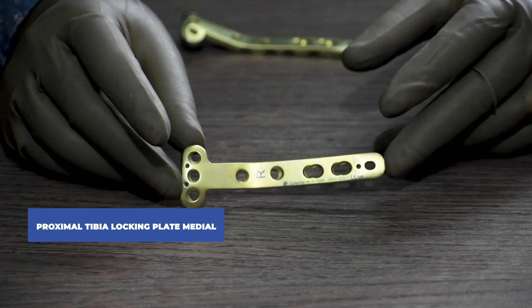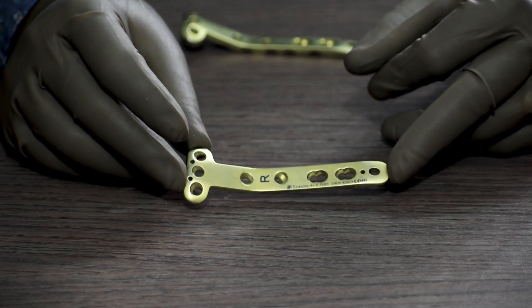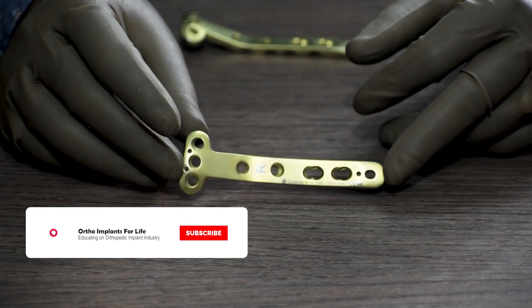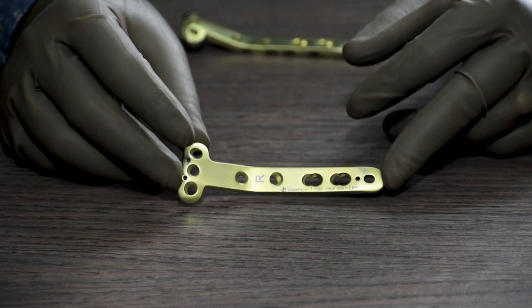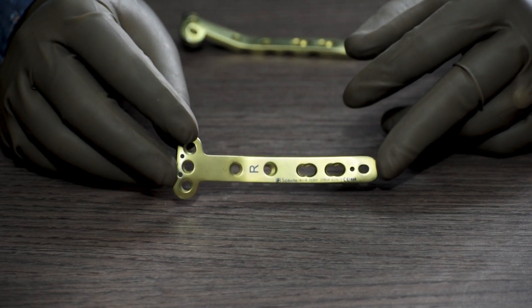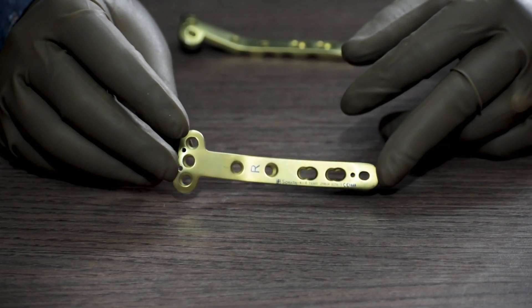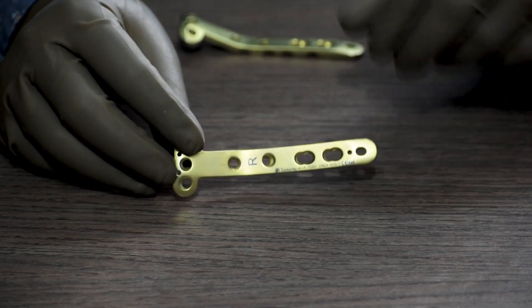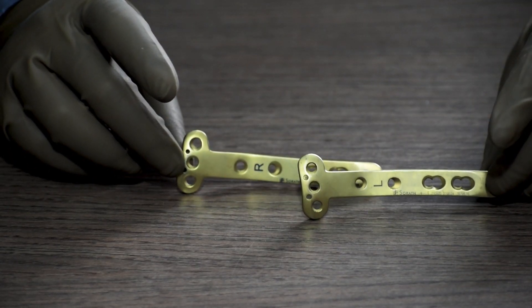And lastly, the proximal tibia locking plate medial 3.5 system. This is also available from 4 holes to 12 holes with 2 holes gap in between: 4, 6, 8, 10, 12. This is a side specific plate, available for both left side and right side.